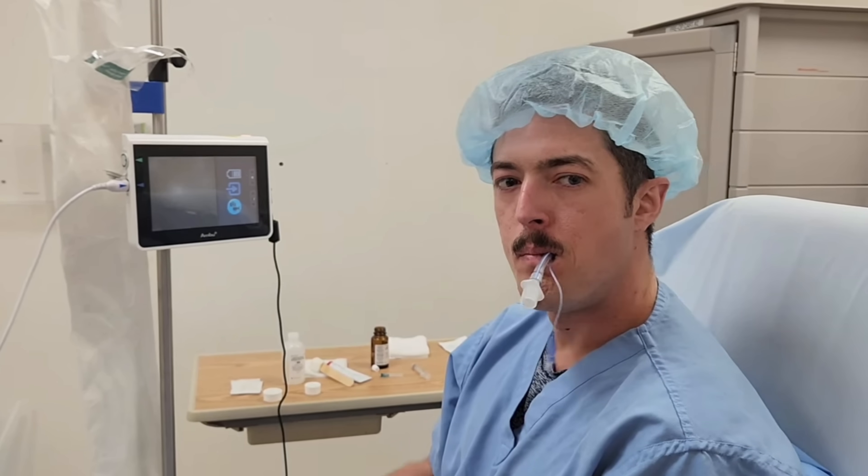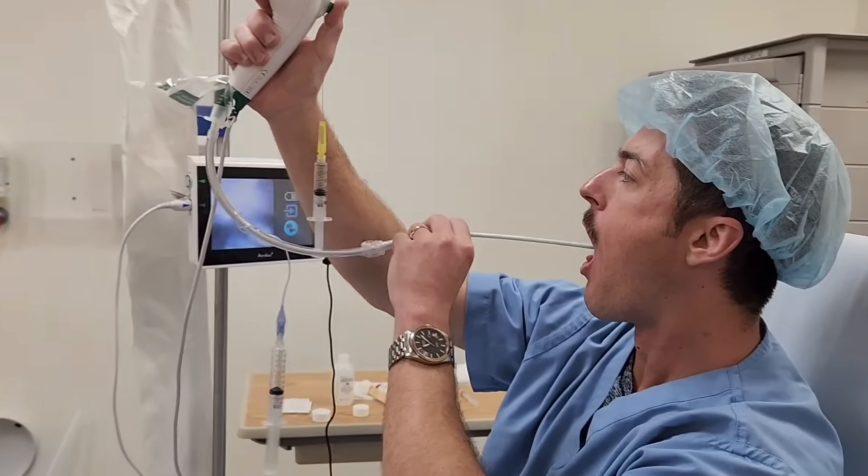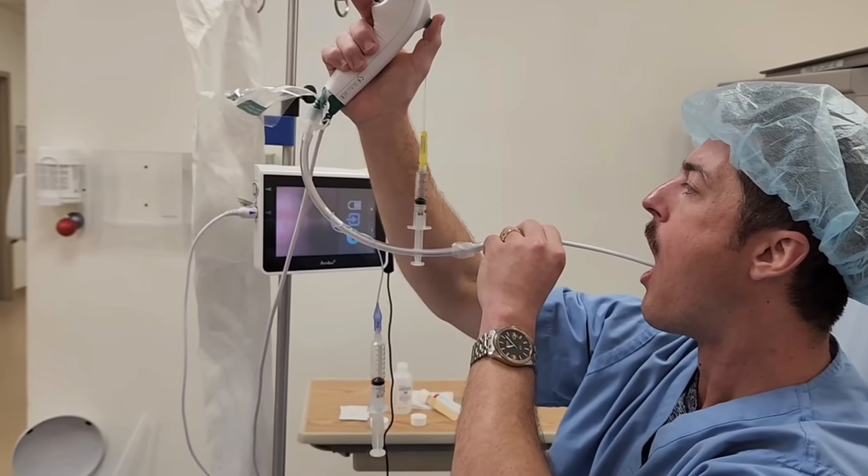While just the thought of being intubated awake sounds like it would be very uncomfortable, as you saw in that video, it's actually possible to make it a pretty comfortable experience for patients. The first step is setting expectations for patients and letting them know what the experience is going to be like, and also getting their input as to how they might want that experience to be. For example, do they want their eyes covered so that they don't see anything, or would they prefer to have their eyes open so they have a sense of what's going on? Talking through every step of what's going on can usually be reassuring for patients, although sometimes patients just don't want to hear anything at all, which is fine too.